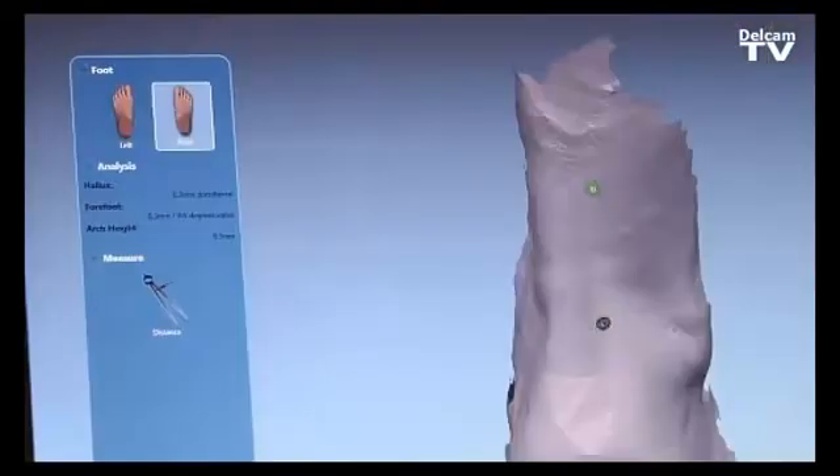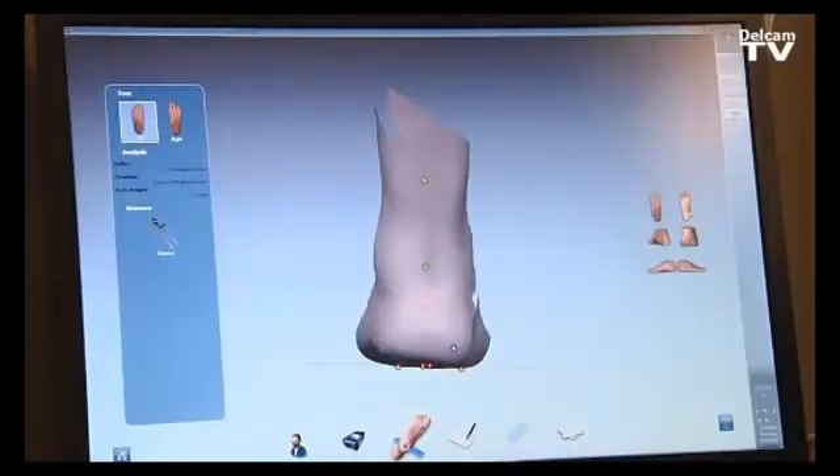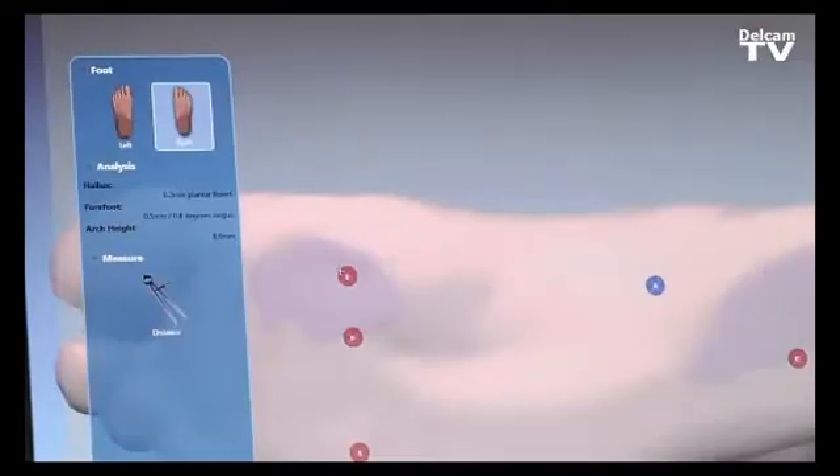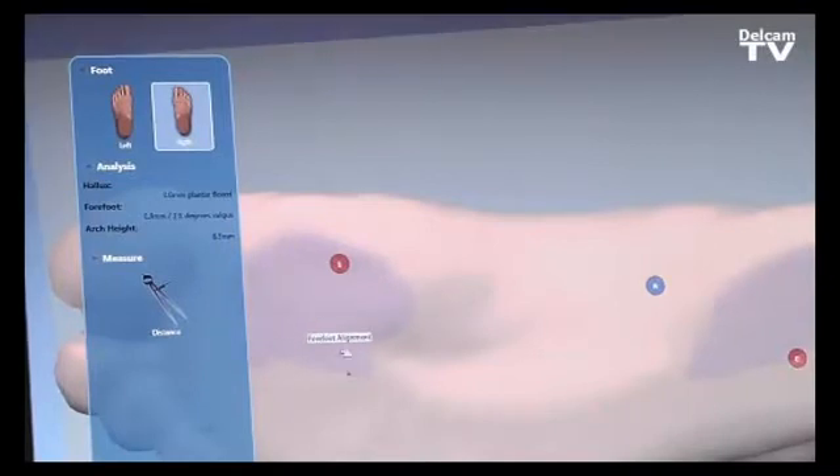We can easily look at the foot from the back and make sure that the calcaneal angle is vertical by moving the points. We can also look at the foot from a plantar view to identify the first metatarsal head. By dragging and dropping these points, the iCube software will update automatically, and you can have a plantar dorsiflexed or plantar flexed location.